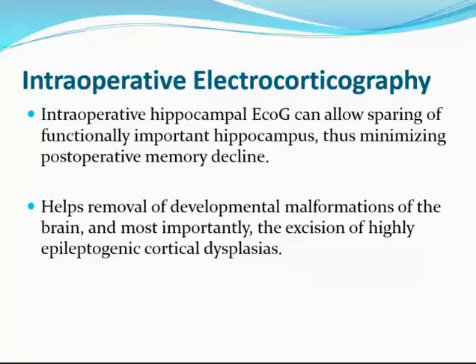So intraoperative hippocampal ECOG allows sparing of functionally important hippocampus, thus minimizing postoperative memory decline. It also helps in the removal of developmental malformations of the brain, and most importantly, the excision of highly epileptogenic cortical dysplasias.